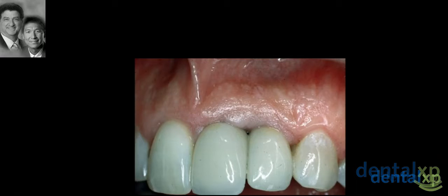I couldn't figure out why. Notice the papilla next to the teeth comes back on both sides. It's not bad. But notice the papilla between the two implants is short. And I didn't know why. I didn't even think about it at the time, to say, well, this is an oddball case. All right, let's just keep going. And like I said, I didn't get hurt by it. The guy accepted the case. He just didn't want the air escaping when he spoke. So we were okay.